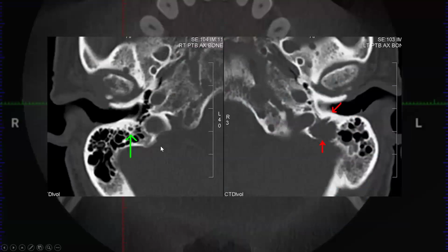Why you need to know anatomy, first of all: you've got to look at these canals, just to point out a couple here. This is the foramen ovale, the spinosum. This is the carotid canal that's coming in. This is part of the jugular foramen. And then there's this extra thing right here that doesn't really belong. This was some lesion in the skull base.